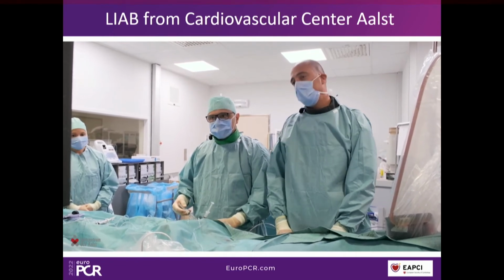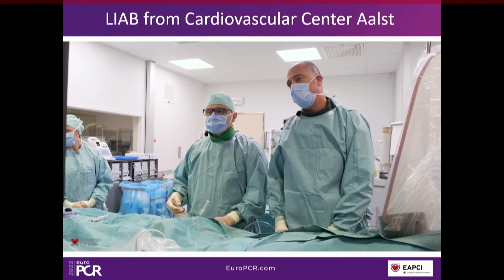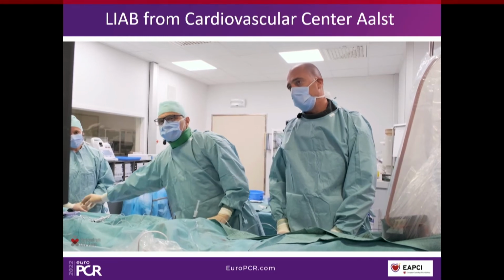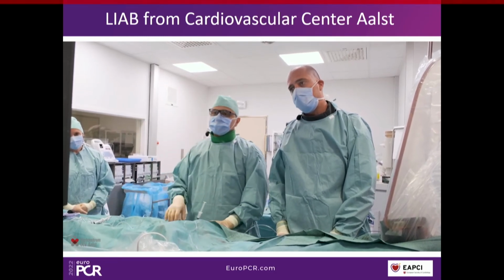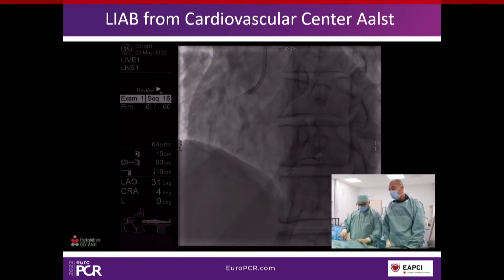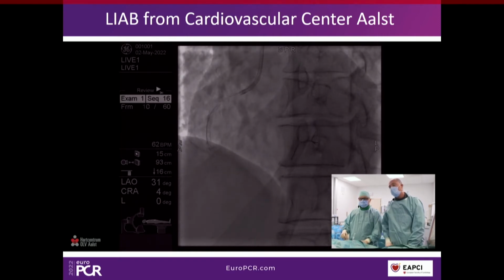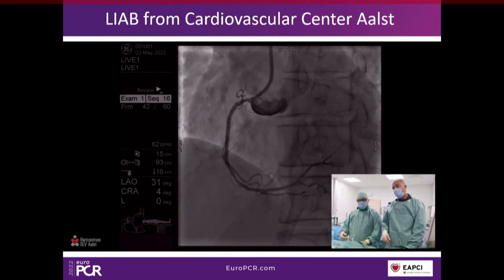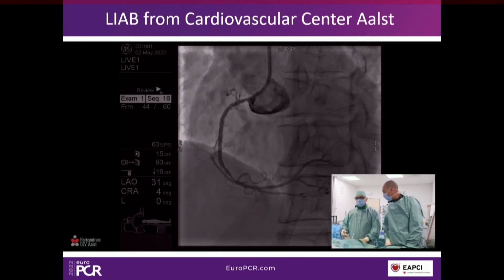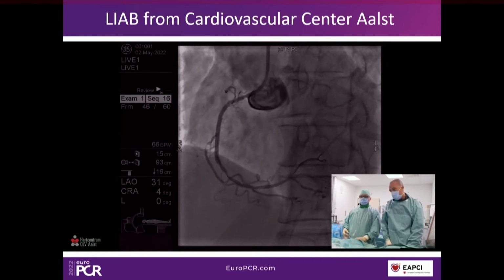Okay, so we have implanted a 2.75/28 stent, and we have seen that there's some residual disease in the right coronary artery. So what we're going to apply now is the PIOS principle, where we will measure the FFR, perform a pullback, and look for residual gradients outside the stent. That could be the target for an extra stent, of course, or a residual gradient within the stent, where you can end the procedure with a stent optimization, of course, to achieve the highest possible FFR.